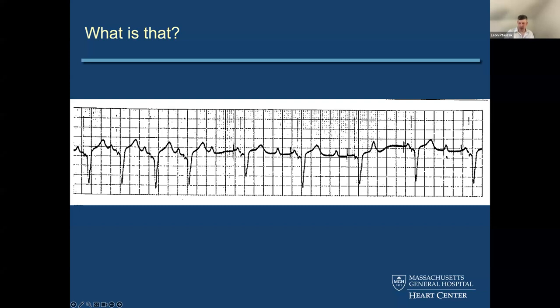Then again, a P wave. I shouldn't say atrial sensing, I apologize, I misspoke. You have a P wave, no obvious response from the device, and it paces the A immediately afterward anyway. And when you have pacing of the A, you have pacing of the V. So what's happening? Well, this is apparent failure to sense in a DDD pacemaker, because you've got these P waves that are not being sensed by the device, and it's coming in and pacing immediately afterwards.